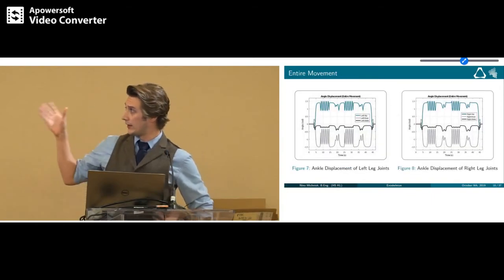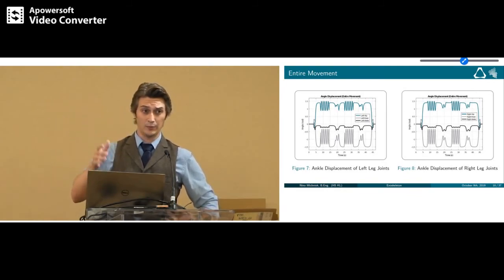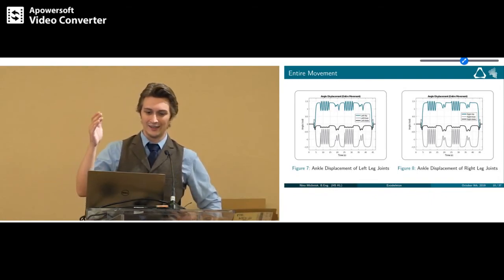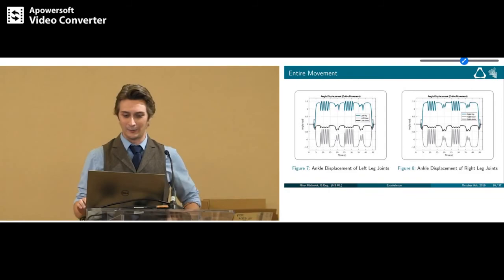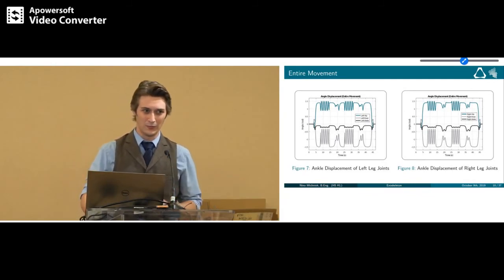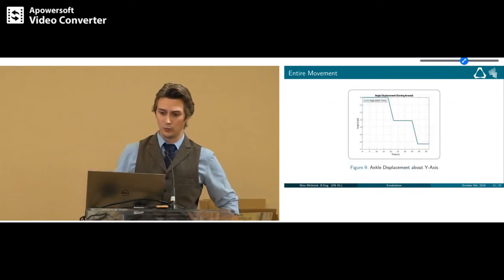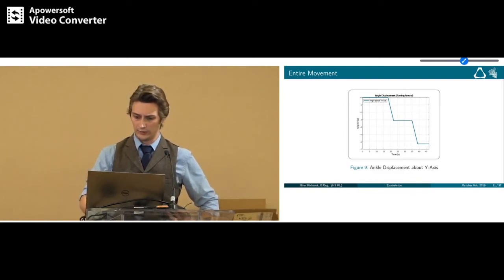You can see these are the angle displacements which I downloaded, consisting for each leg of standing up, walking 5 steps, with 2 legs it's equal to 10 steps, then turning around, again walking, turning around, and sitting down, which is basically just a reverse of standing up of the angle displacements. But the human dummy didn't turn as required by just making some leg movements. So what I had to do is add an external motion about its y-axis, so it turns to precisely minus 180 degrees when it does its turn, and then in the end back to its initial angle.